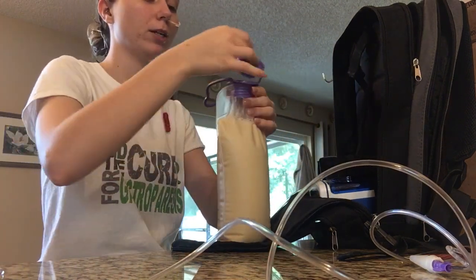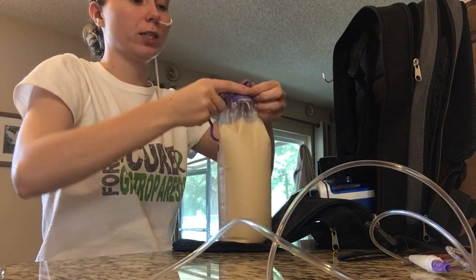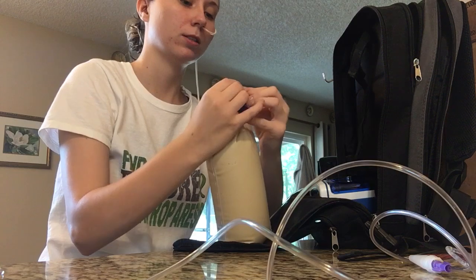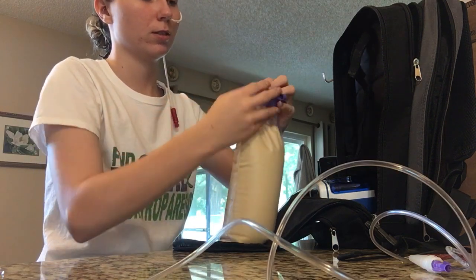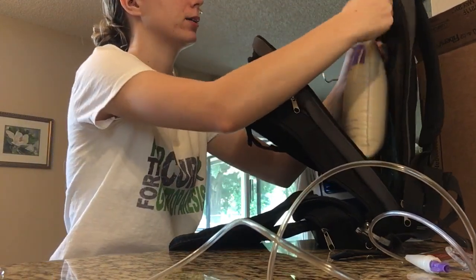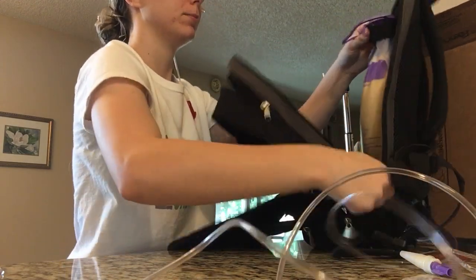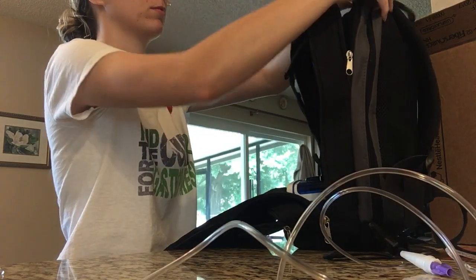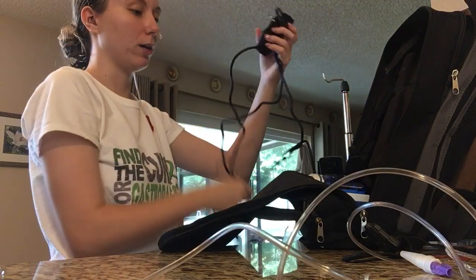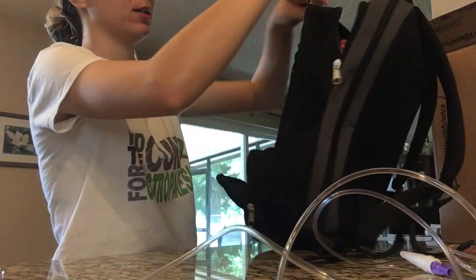So I'm going to take my bag off of my hook and I'm going to close it. Make sure this is really tight so no air gets into your bag. And then I put my formula in the back, nice and tight, and then I zip it up. I also keep the charging cord in the bag as well, and I put that in the front just on top of the pump. And I zip that up.